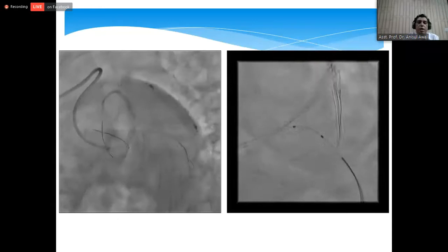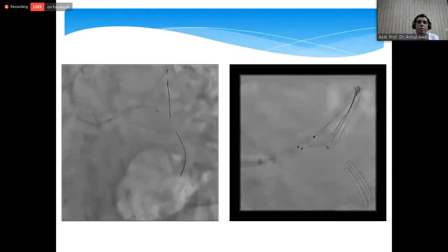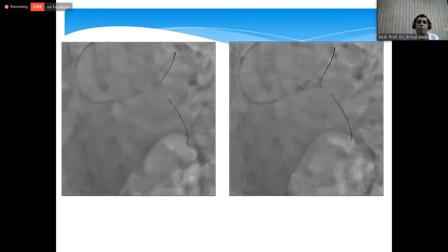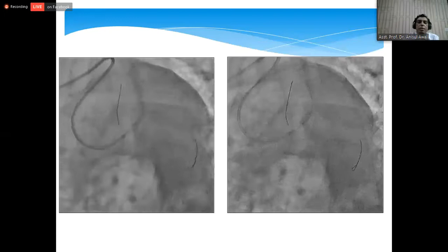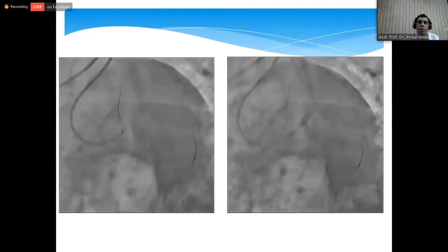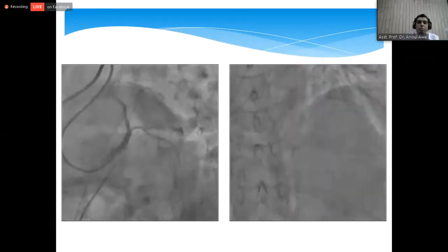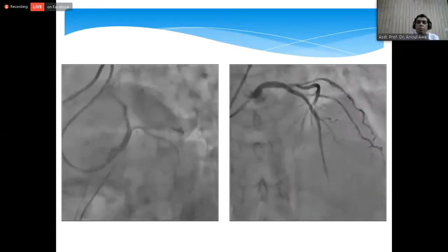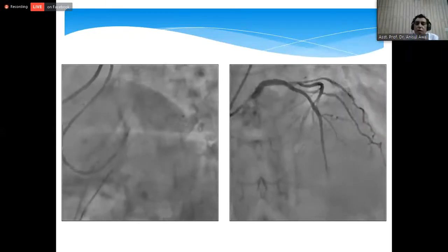So we decided to recross, and this time we recrossed through the distal strut of the stent. We took a 2.5 size balloon and dilated, then did the final kissing, and also the final POT, and we made a flare with this high-pressure balloon. With this double provisional stenting, we stabilized the patient, and she is symptom free, and we're happy with the result. But due to lack of an IVUS facility in our center, we couldn't check the result optimally.